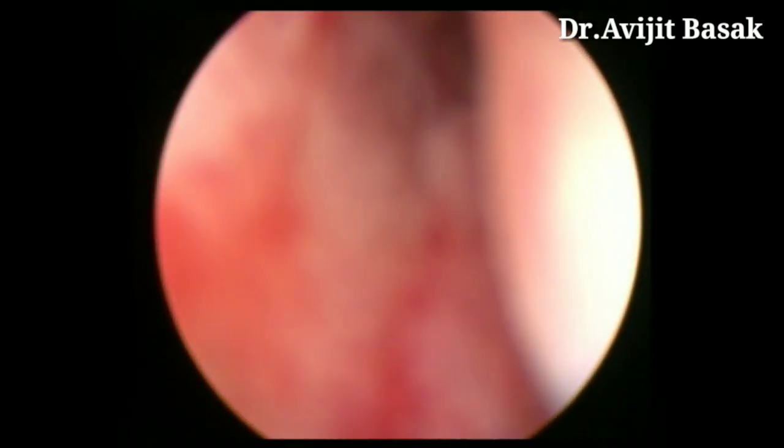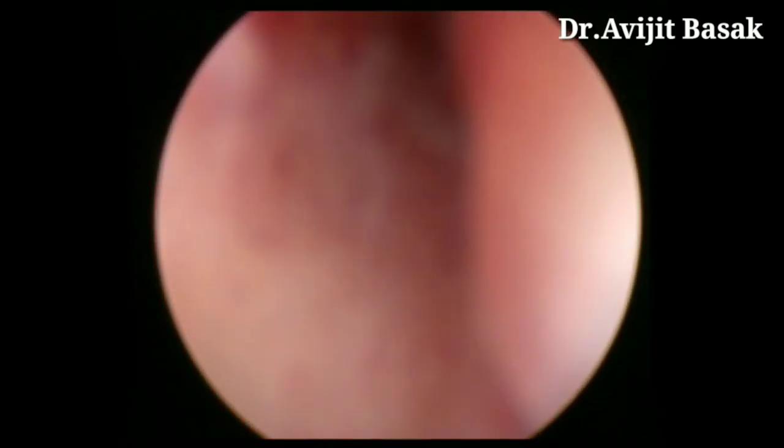We now demonstrate how to perform diagnostic hysteroscopy. Saline is used to distend the cavity. This is the cervix external os, and now we pass through the internal os. This is the endometrial cavity.